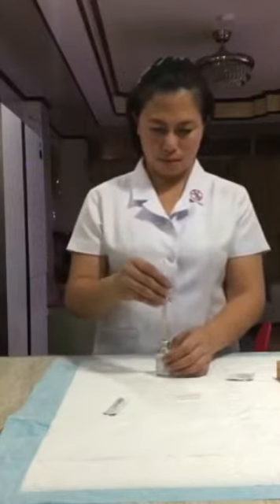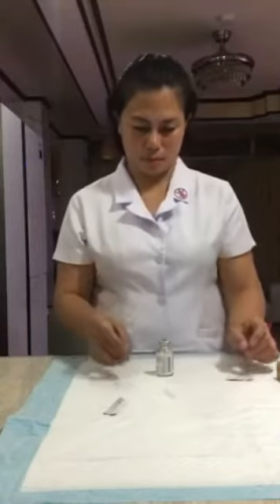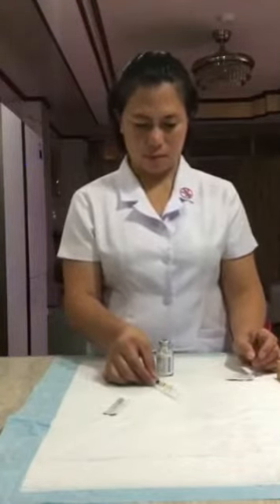Avoid drawing up the last drops of the vial. Proponents of this method say that keeping the vial in the upright position while withdrawing the medication allows particulate matter to precipitate out of the solution. Leaving the last few drops reduces the chance of withdrawing foreign particles. Or invert the vial, ensure the needle tip is below the fluid level, and gradually withdraw the medication. The rationale for this is keeping the tip of the needle below the fluid level prevents air from being drawn into the syringe.